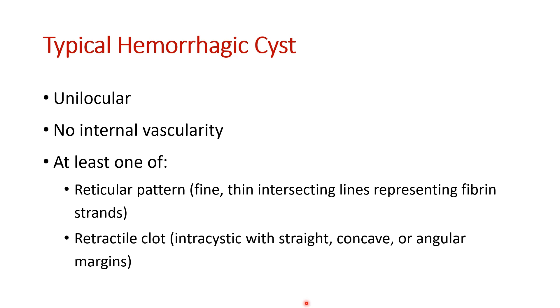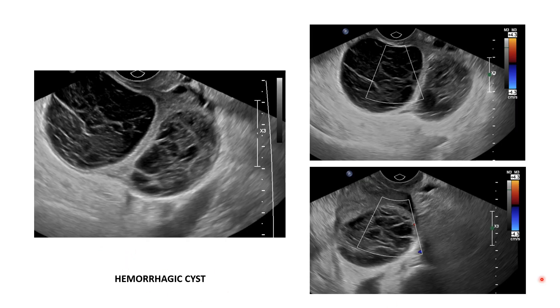A typical hemorrhagic cyst is unilocular, does not contain internal vascularity, and should contain at least one of these: the reticular pattern, mesh-like fibrin, or a retractile clot. There are two hemorrhagic cysts in the same ovary in this patient, with a reticular pattern inside like a meshwork without any vascularity. These are two typical hemorrhagic cysts.